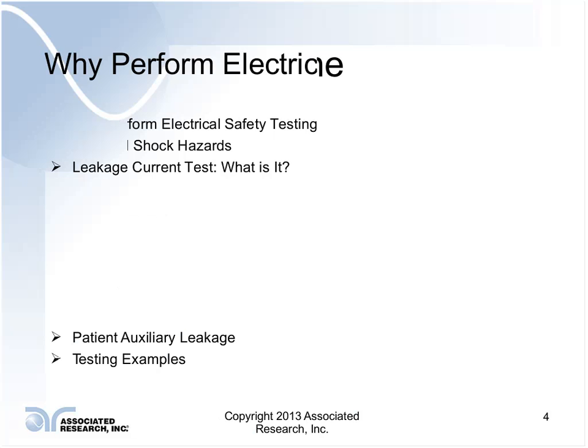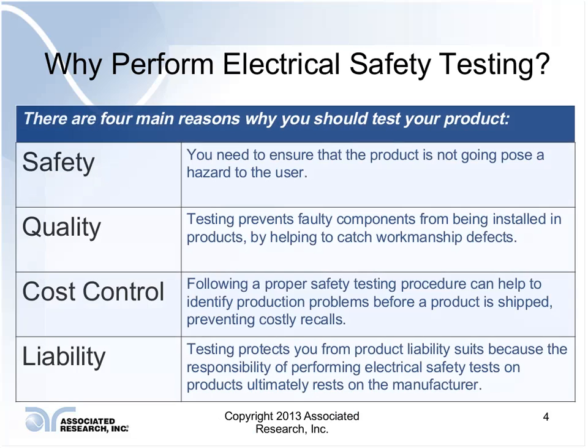So why perform electrical safety testing? Well, there's really more than 4, but the 4 main reasons are as follows: safety, quality, cost control, and liability. Obviously, for safety, you need to ensure that the product is not going to pose a shock hazard to the user. Whenever you're dealing with a standard, there is a slew of tests that are run on it. Here, we've just focused on a narrow bit of that, under the spectrum of the electrical safety test, and even narrower, talking about the leakage test itself.